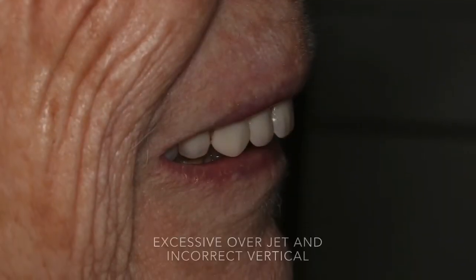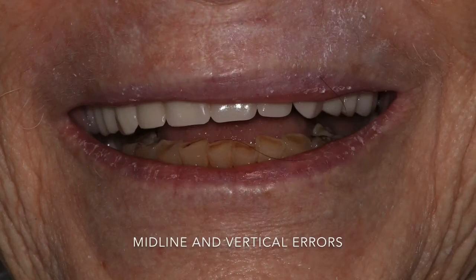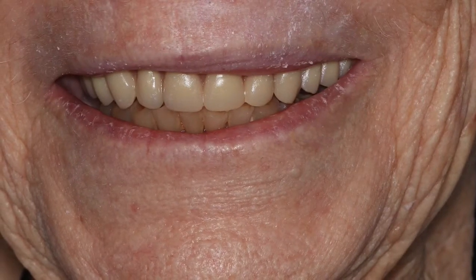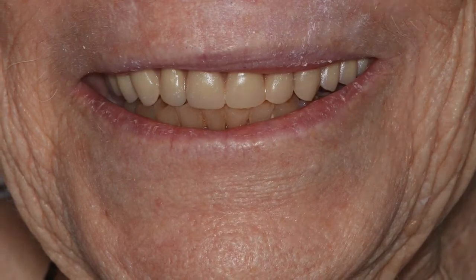In profile you can see it's because the overjet was way too excessive and there was insufficient vertical. Her second set was not much better — inappropriate vertical and the midline was off. Here's a much more appropriate denture that was made for her. The color is better, the midline is better, and the vertical was increased so that she didn't have the excessive overjet.